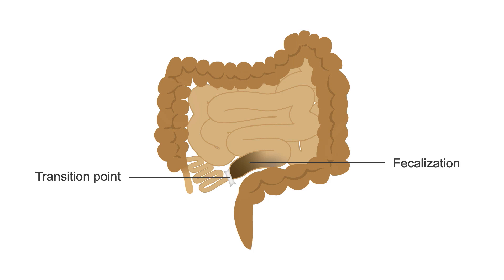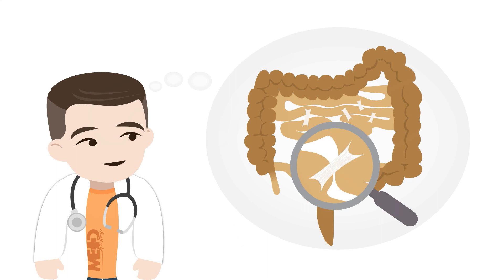Fecalization occurs here because the bowel contents have sat there the longest, and over time the water content becomes resorbed, causing it to take on the appearance of stool. Recall that adhesions are the most common cause of obstruction, but these are not visible on CT. You will have to rely on the dilated small bowel, angled or tapered transition point, and fecalized contents to help you infer their presence.